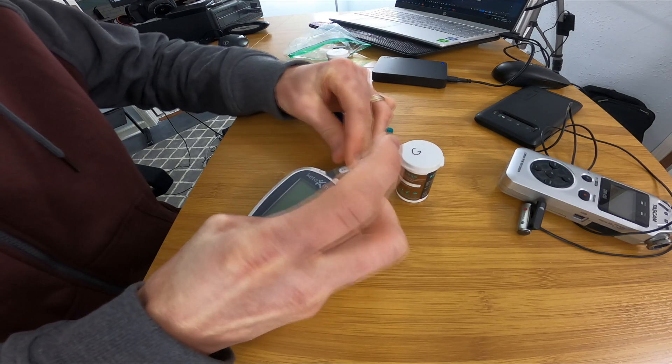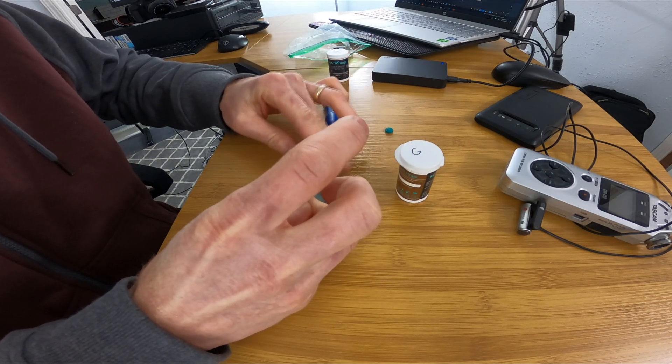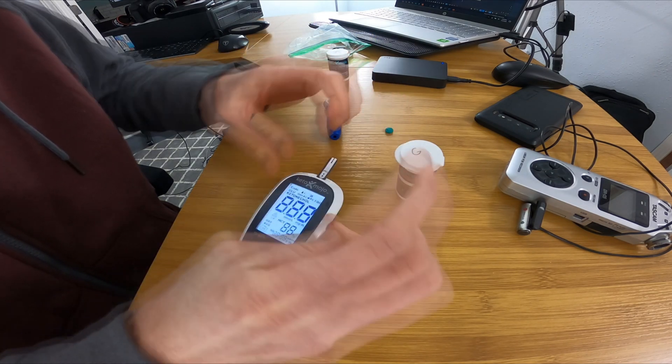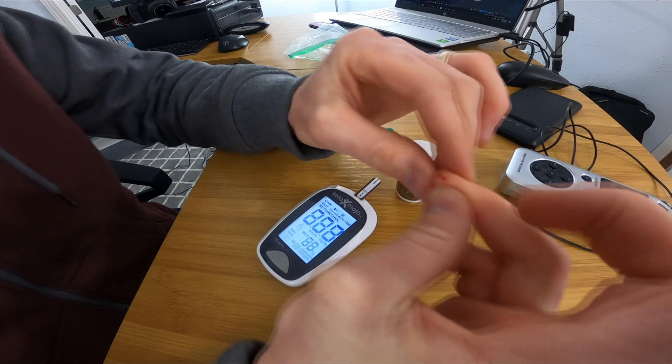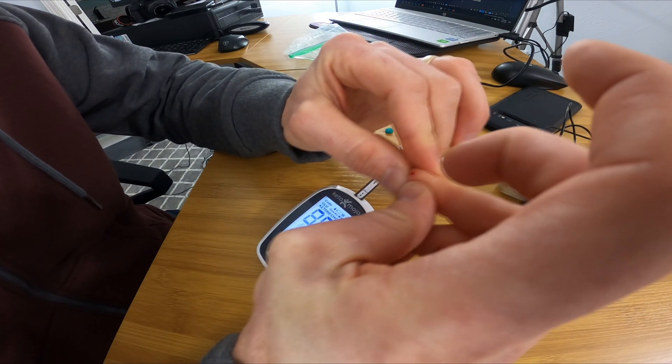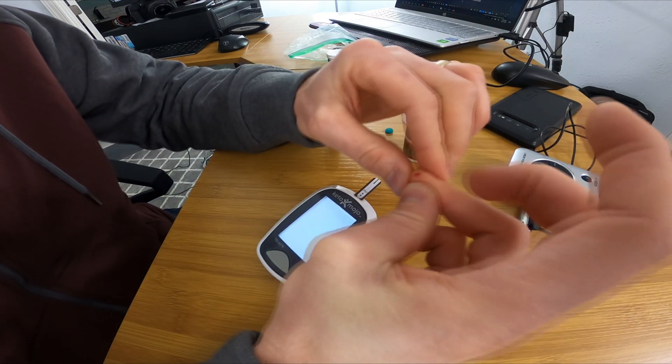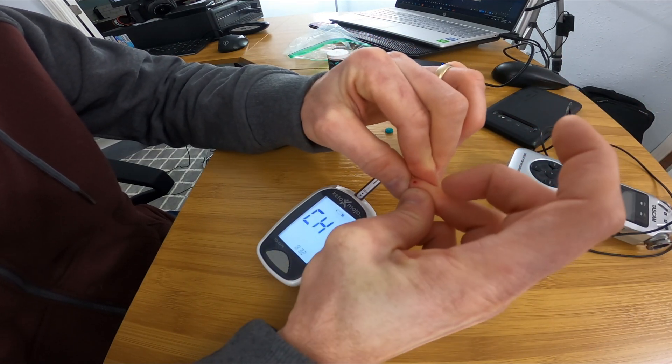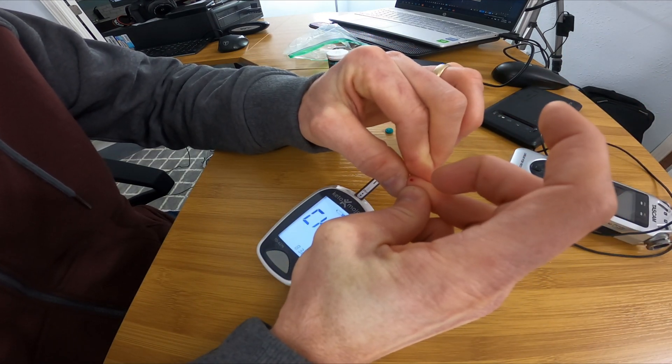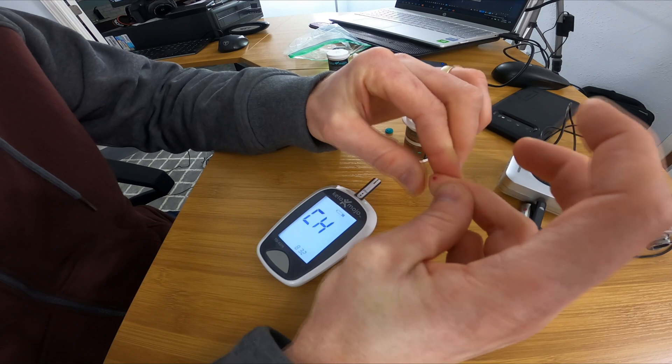Now that I have a drop ready to roll, I push the glucose strip into the machine. This automatically turns it on, and it starts blinking when it's ready.